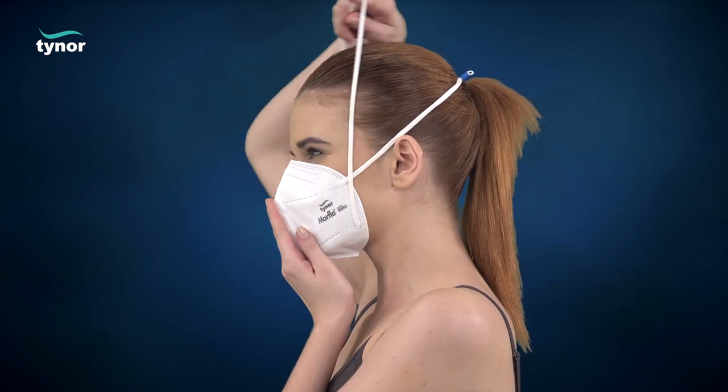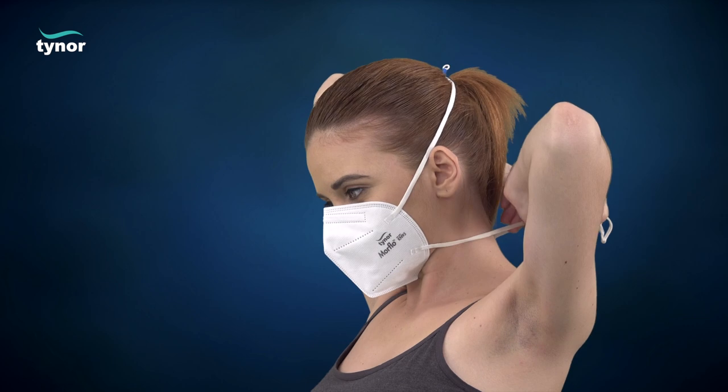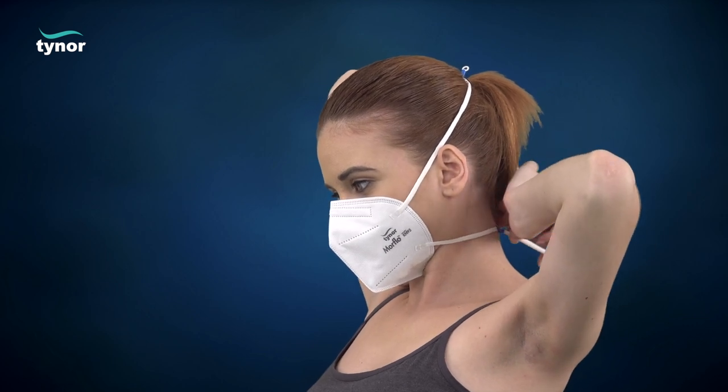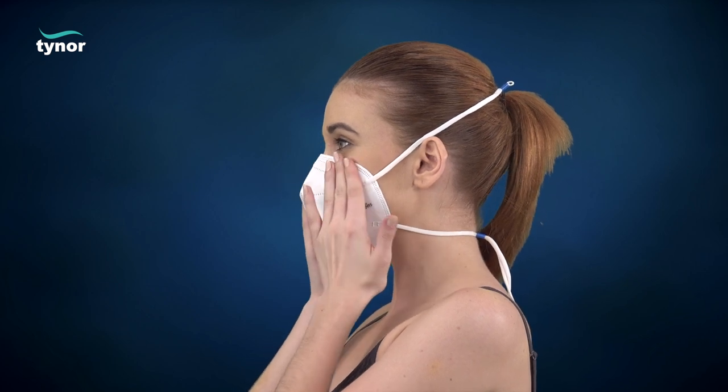Pull the top strap over your head and position it above the ears. Next, pull the bottom strap over your head and position it below the ears. Match the nose clip to the anatomy of your nose to achieve a good seal.